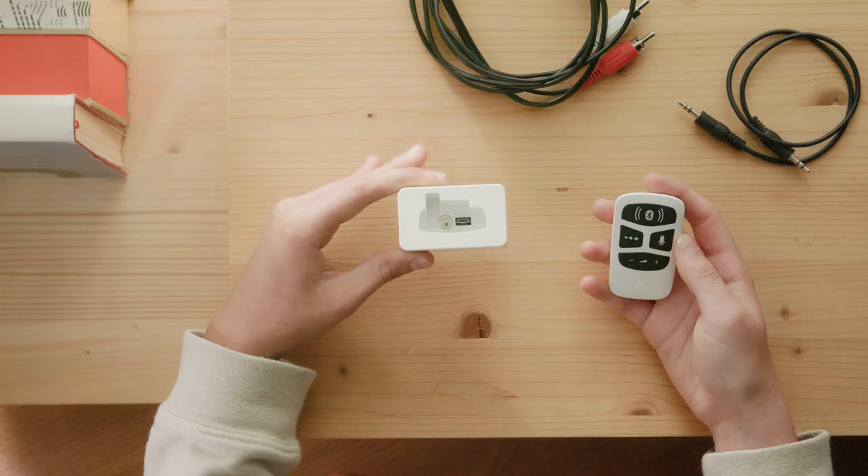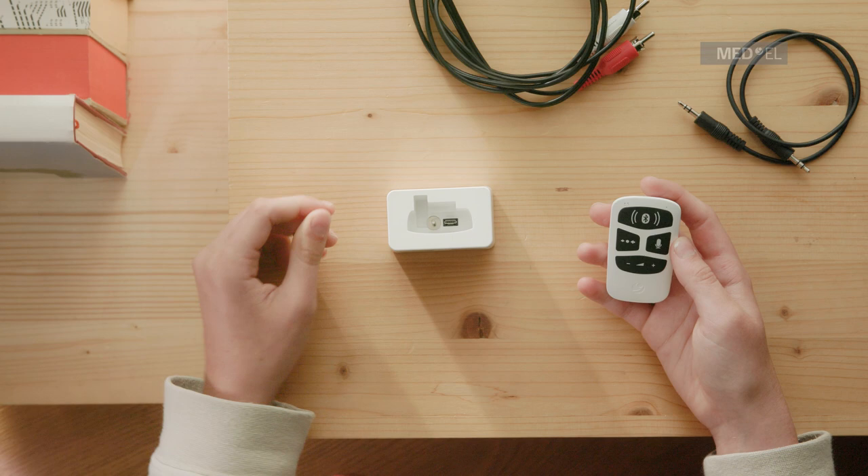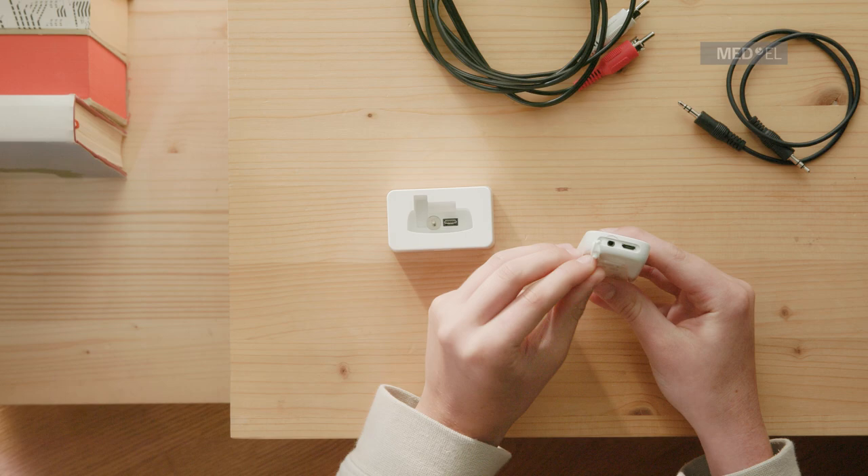You can use AudioLink together with a docking station to stream the sound from your TV directly to your audio processor.